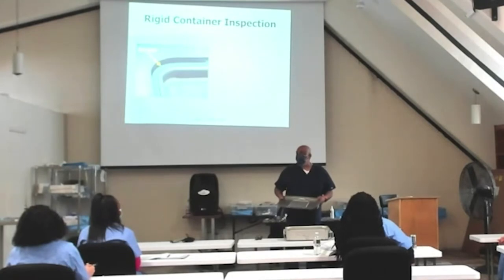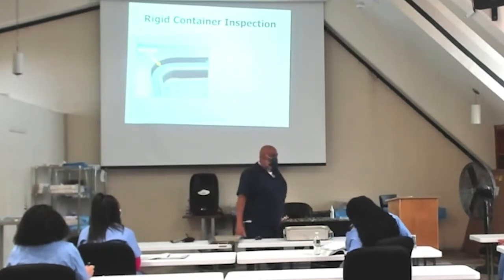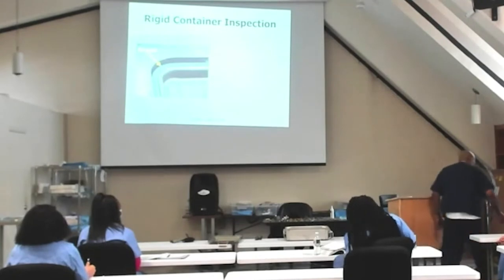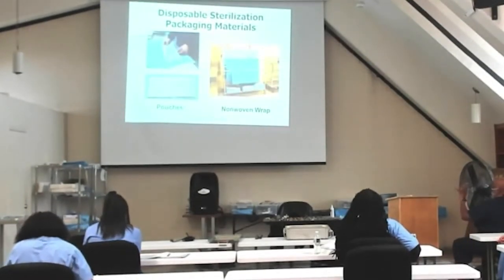Inspection of all of our equipment is kind of mandatory. Because that's how we can detect defects, if we know what we're looking for and where to look for it, okay? Now, we inspect all the components, yes. And here are our three methods.